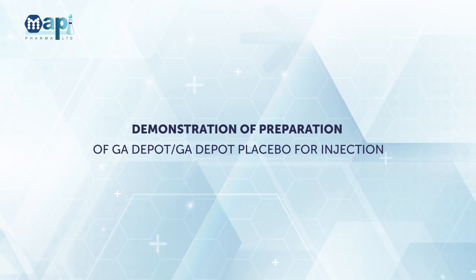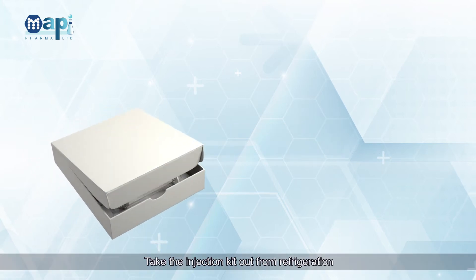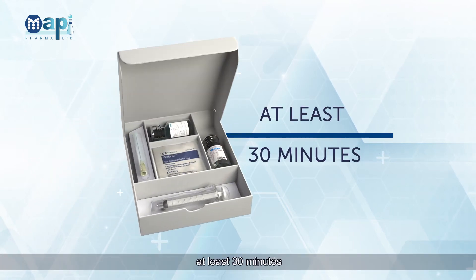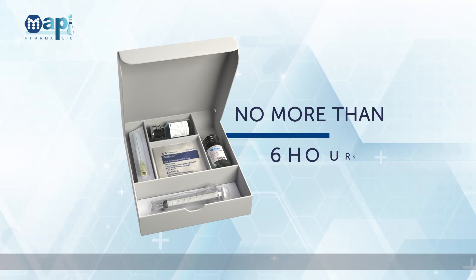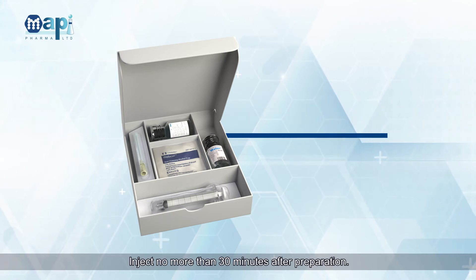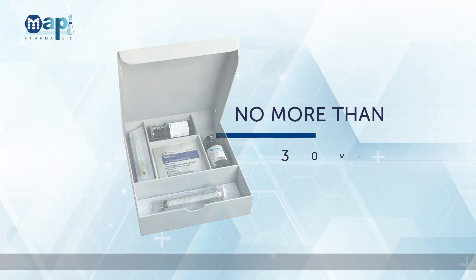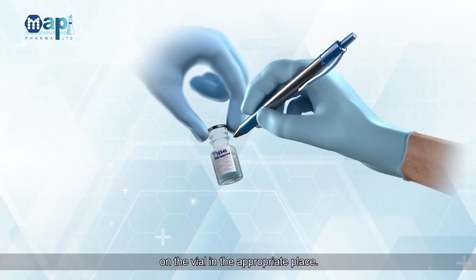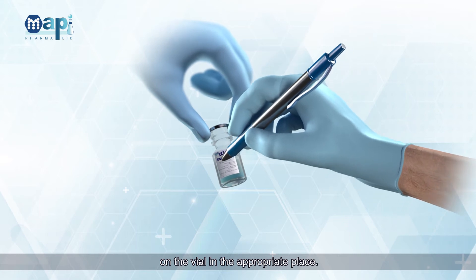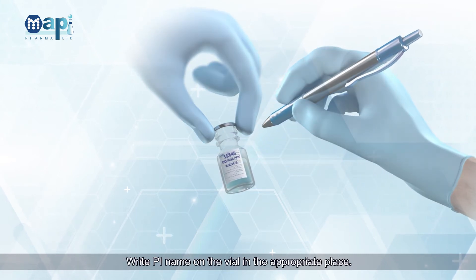Demonstration of preparation of GA Depot and GA Depot Placebo for injection. Take the injection kit out from refrigeration at least 30 minutes and no more than 6 hours before the dosing time. Inject no more than 30 minutes after preparation. Write the subject's number, visit date, and PI name on the vial in the appropriate place.